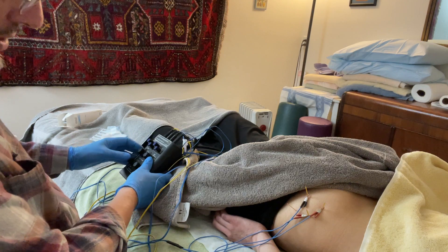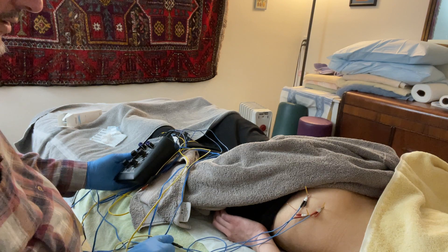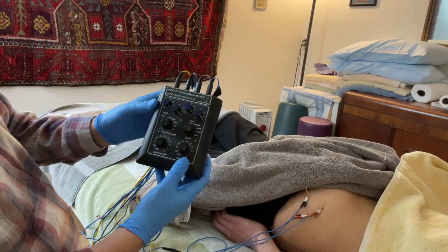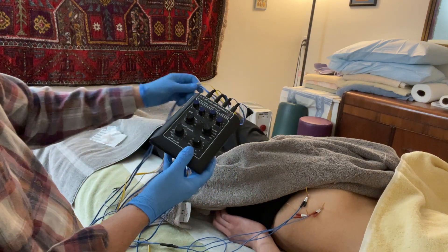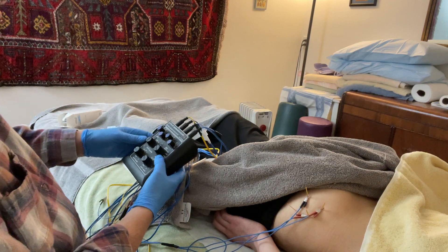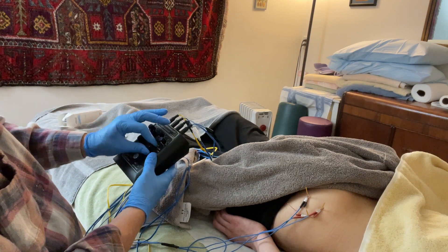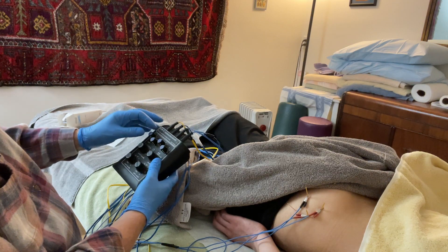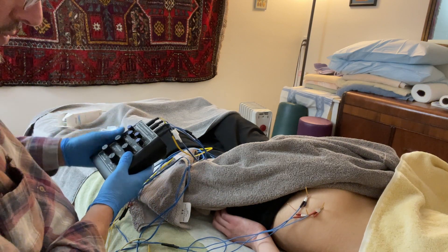Now I'm going to turn these on. This is an American-made machine by Pantheon Research in Marina del Rey — it's the best machine I have found. It has to do with the quality of the pulse wave. Everything's off — I'm going to put it on continuous and start it at one; that's the frequency.